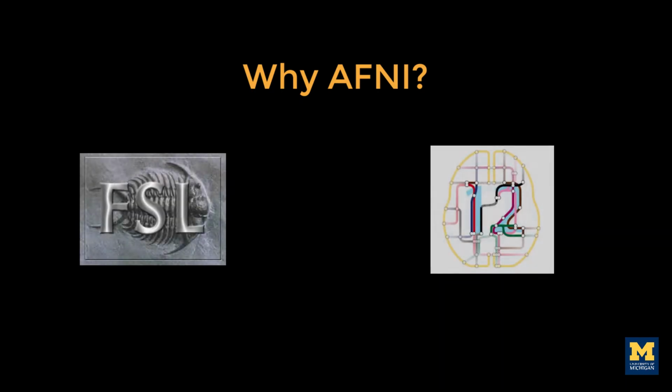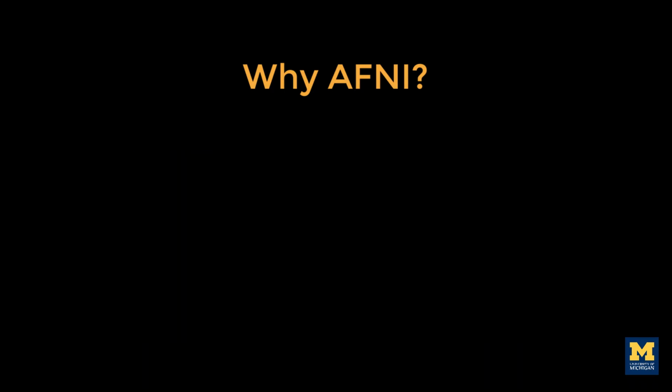At this point, you may wonder, why AFNI? Why not one of the other analysis packages, such as FSL or SPM? Ultimately, the decision is up to you, and you'll need to consider many things, such as your operating system and whether your lab prefers one package over another. In any case, AFNI has several unique advantages.